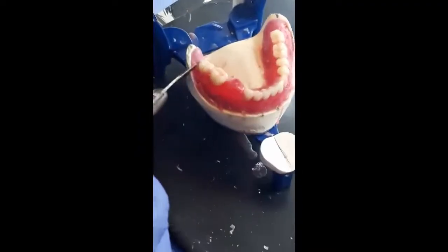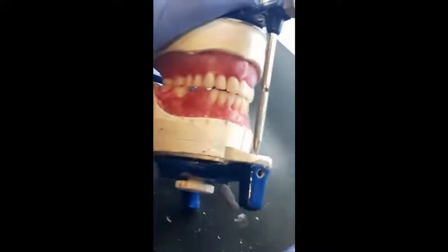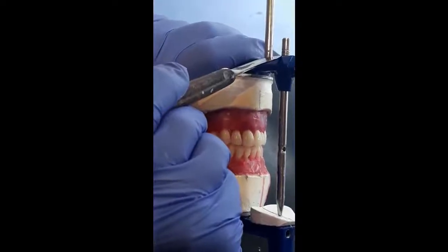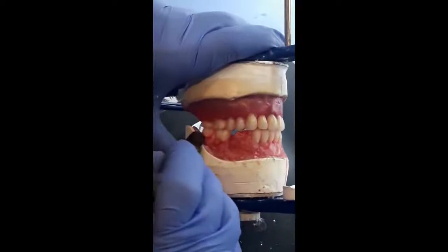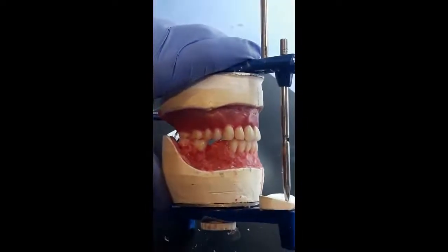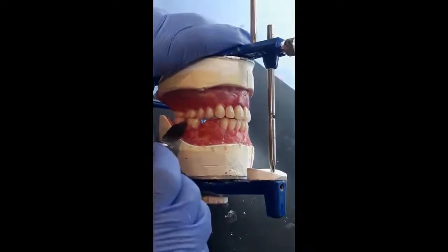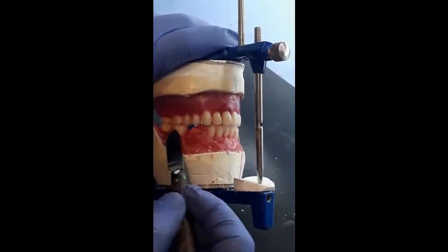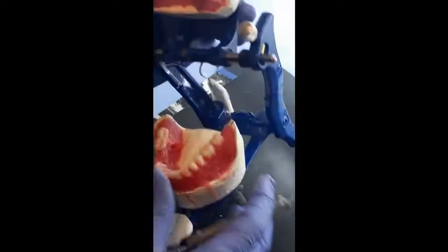Usually we don't need to, but sometimes it depends on the size of the teeth. Now you can see the pin is closing completely. As you see here, the zero line is flush with the upper surface of the member, and we have enough space here, so I raise it a little bit to articulate with the maxillary second molar in the proper relation. Now I fix it from inside.